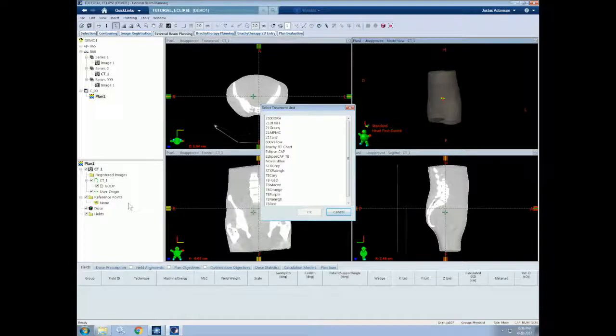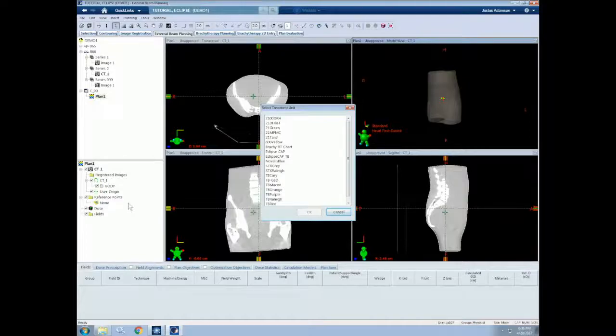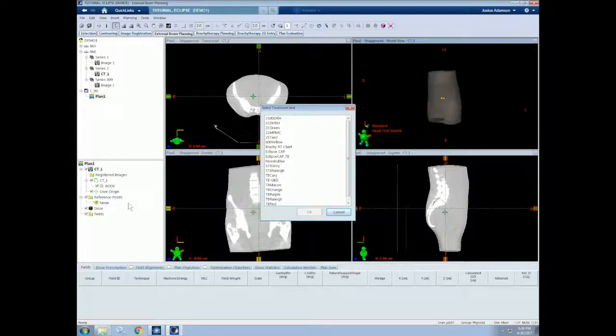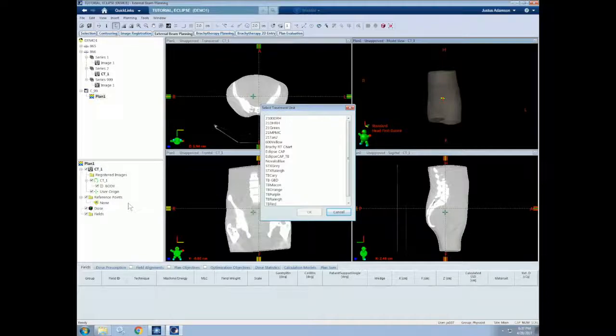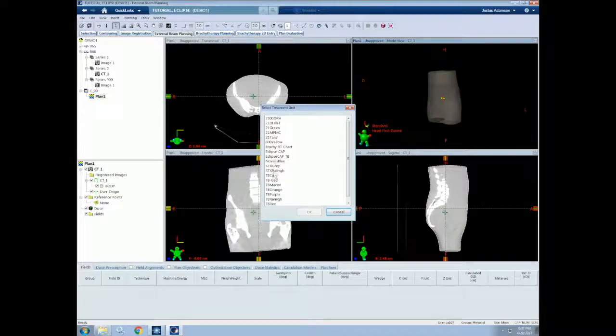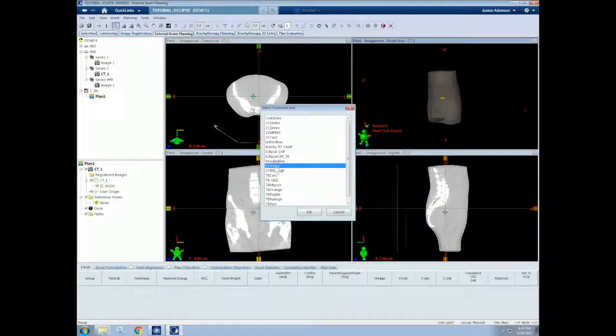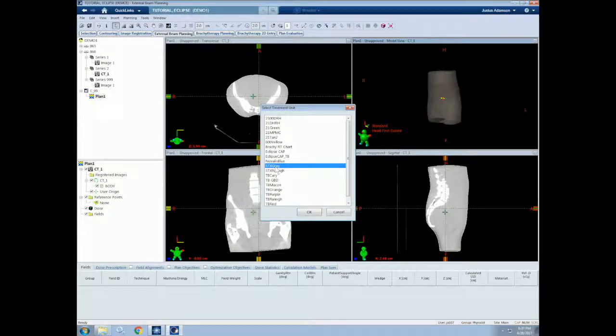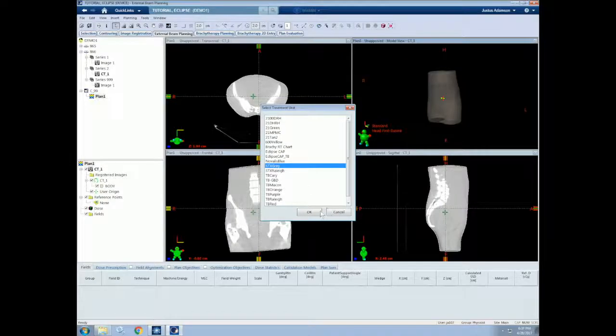When we insert a field, the first thing that we will need to do is select the treatment machine. This is important when planning because you need to consider what treatment techniques, beam modifiers, energies, and dose rates, as well as other treatment parameters, are commissioned for each machine. Selecting a machine here will indicate which commissioning and beam data to use for dose calculations. Let's choose the STX Grey. This is a Varian TrueBeam STX unit that is commissioned for radiosurgery.